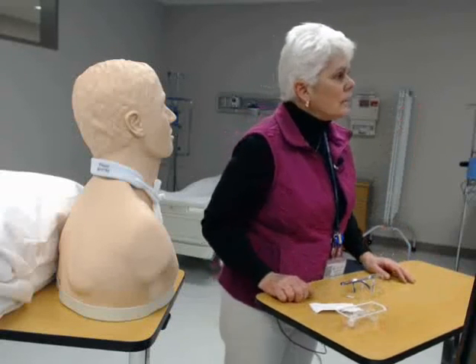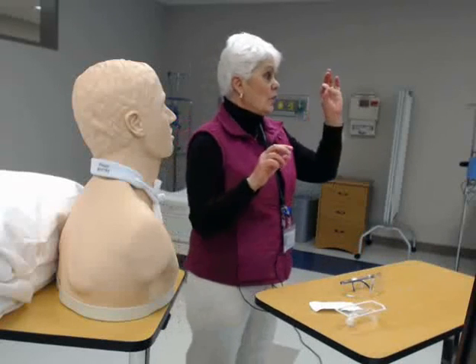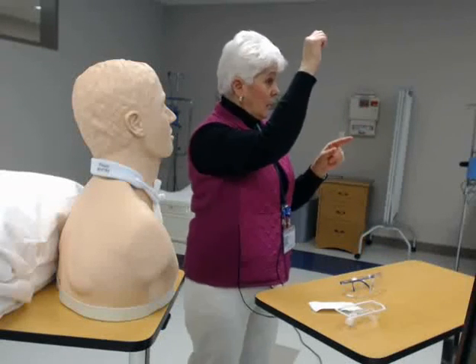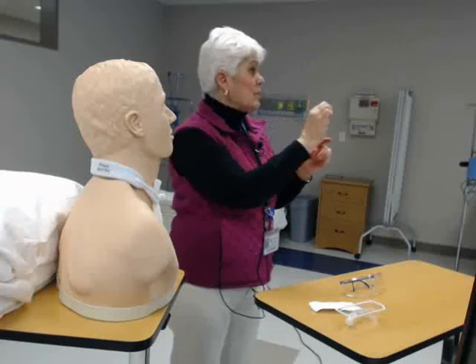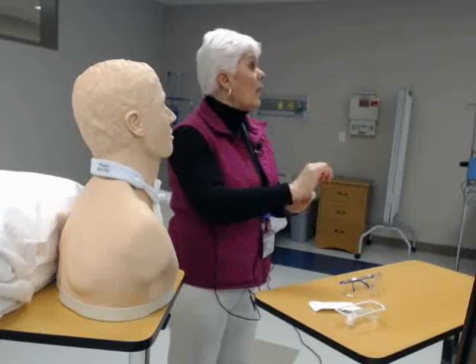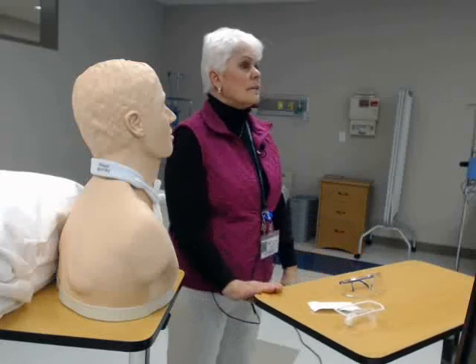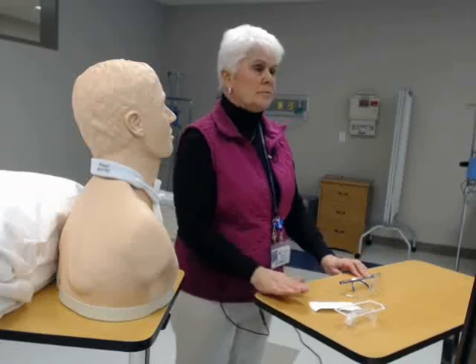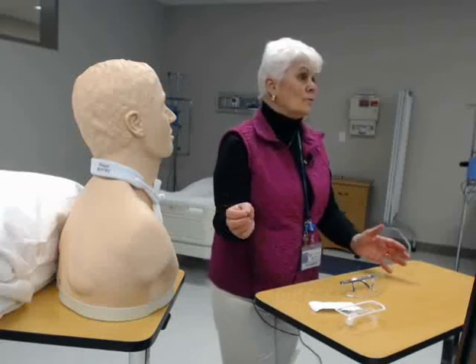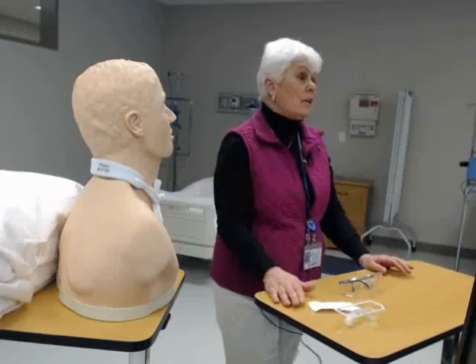Question about the cotton-tipped applicator technique: you clean under the stoma — the actual skin is called the stoma — lifting the plate a little and going underneath top to bottom. Question: Can you wet the cotton applicator? Yes. Question: With the disposable inner cannula, do you wet it before inserting? No, you don't have to — it can go right in. The moisture from the saline helps lubricate the reusable cannula, but the disposable one goes straight in.